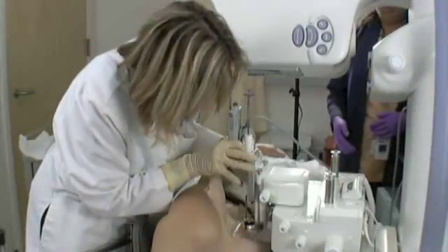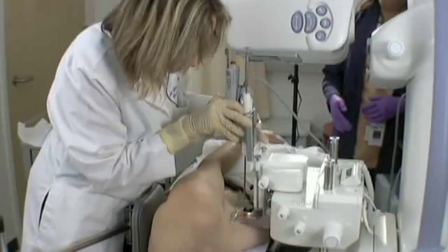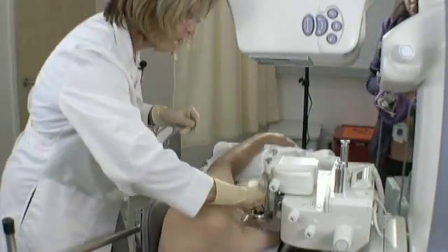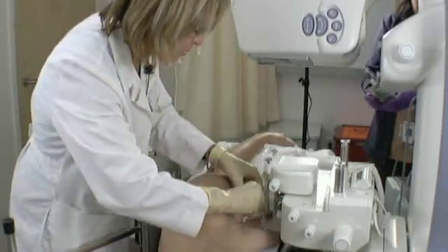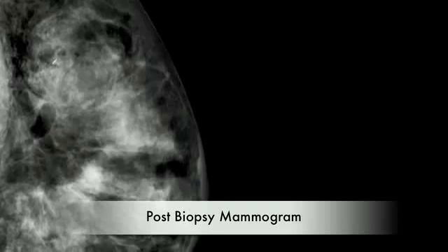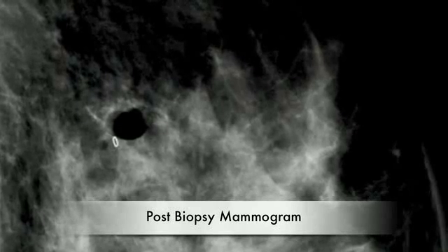I'm just going to pull the needle out of your breast — you're going to feel a little thing drop on your skin, that's okay. We are finished. We'll hold a little pressure here with you in this position. You did great — you didn't bleed at all. The post-biopsy mammogram of the left breast demonstrates the tissue marker in the upper outer quadrant at the biopsy site. A few residual microcalcifications are present in the area, and no hematoma is present.